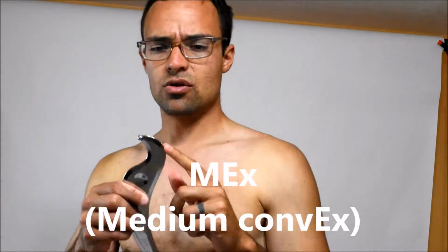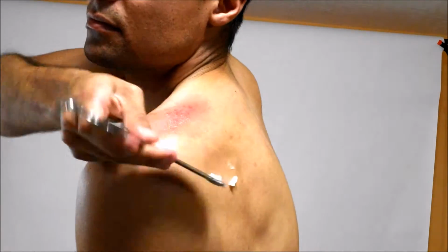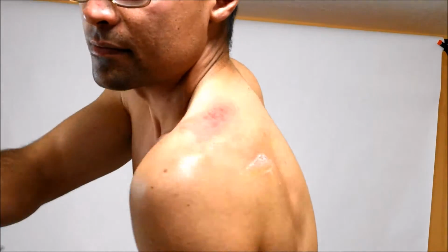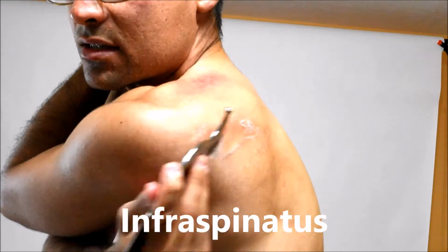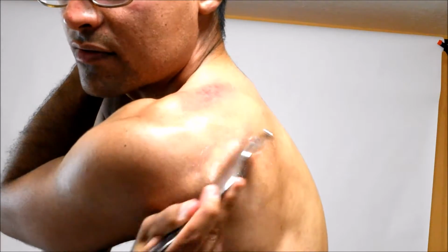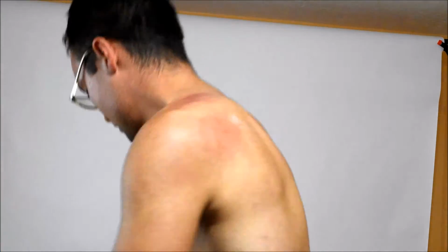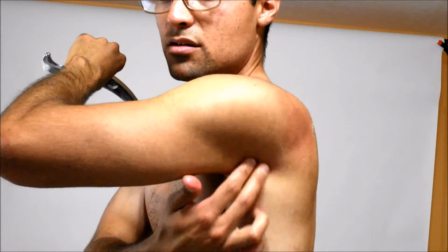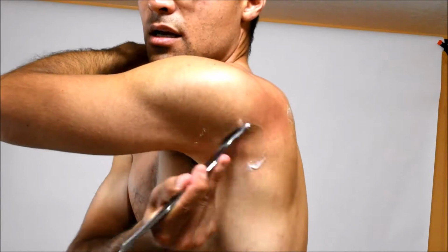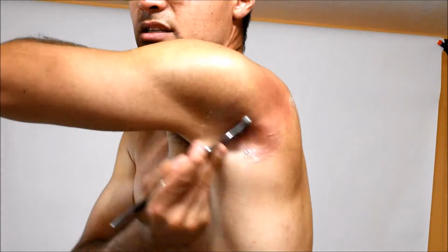Another good edge to use on the shoulder is MEX, medium convex. 6, 7, 8, up to 20. There we go. And we're also going to get these teres muscles here. The teres are also commonly affected with shoulder issues, so I'm going to apply some emollient. And here we go. 12, 13, up to 20.